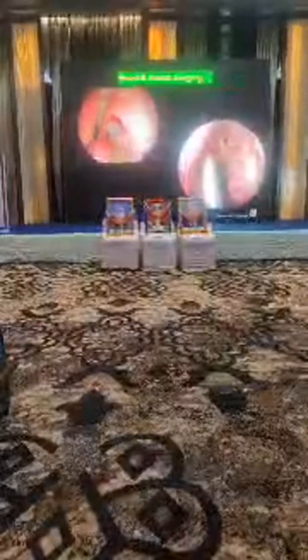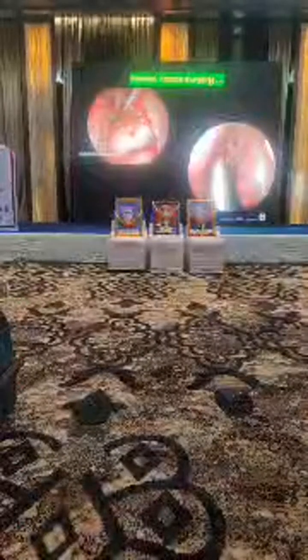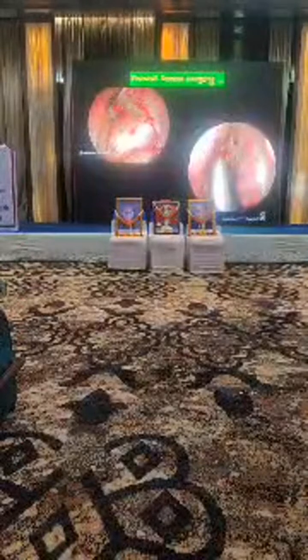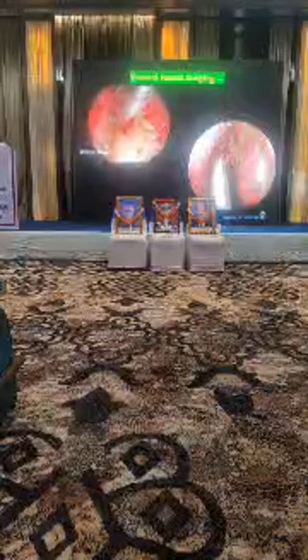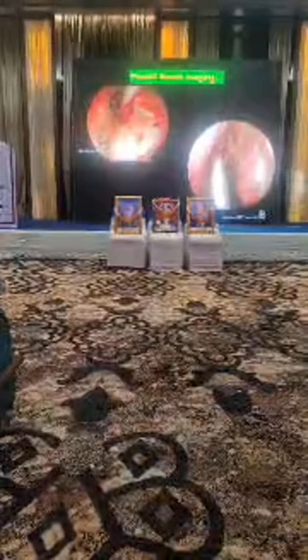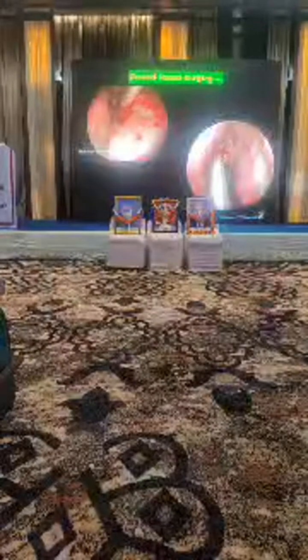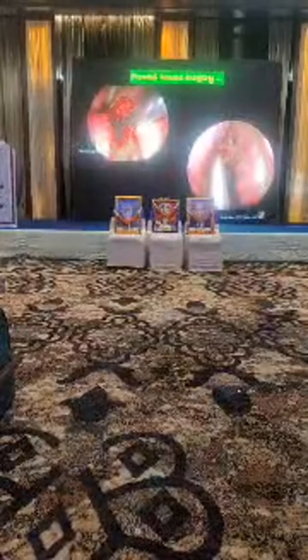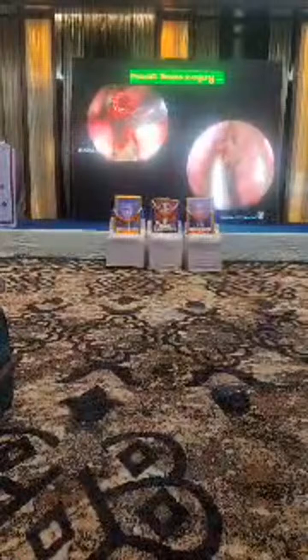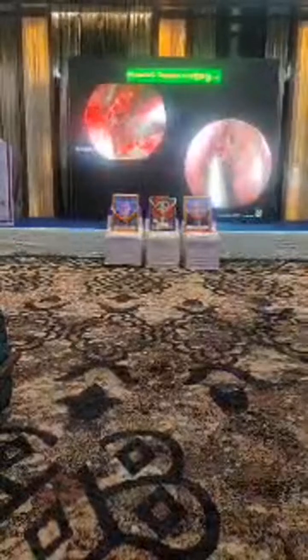Then this video shows the uncapping of the agger, where in the left nostril, by ball probe, I am palpating the posterior wall of the agger cells, and without injuring the surrounding mucosa with the ball probe or with the J curette, I am outfracturing the cells. I am going posterior to that lamina and I am dissecting that lamina. And after outfracturing this lamina, the rest of the thin bone and the mucosa we can divide out. This is the uncapping of the agger. Only a single agger cell is there.